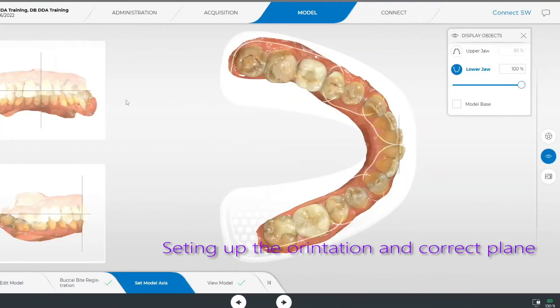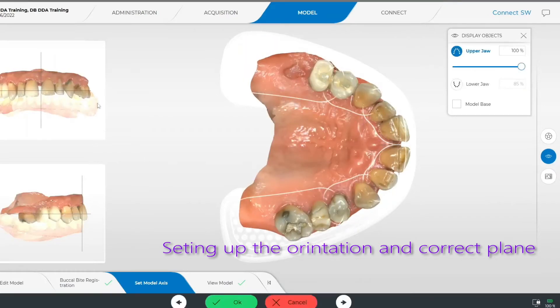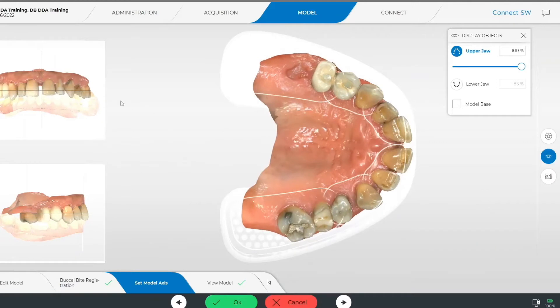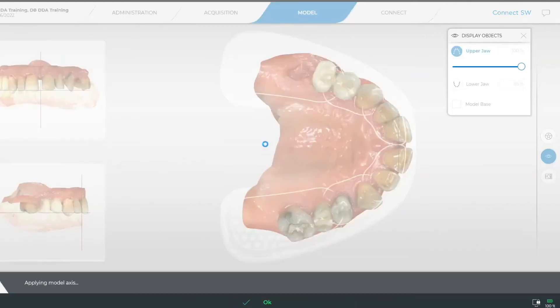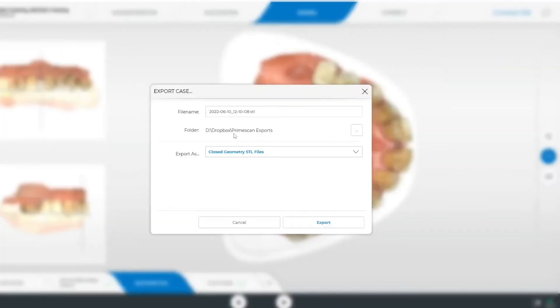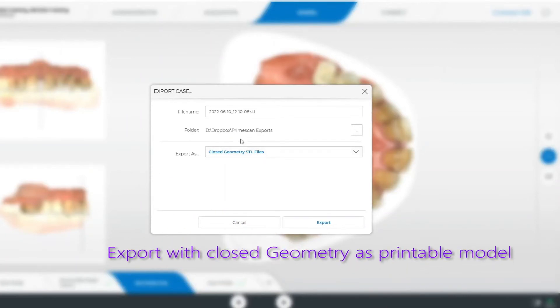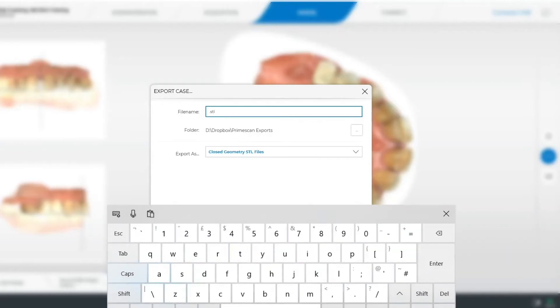In this step, it's important that we orientate our model correctly. We set the axis, orientation, and plane of the model in order to ensure the correct export of the 3D model. Our final step is to export the model as a closed geometry STL either to a Dropbox folder or USB key in order to send that file directly to the printer software.